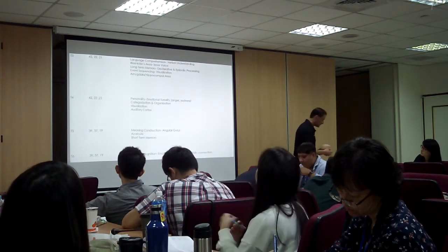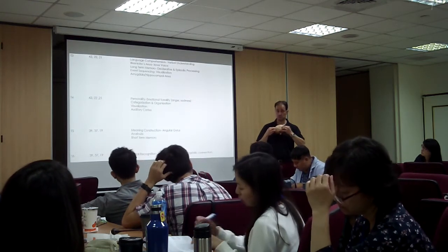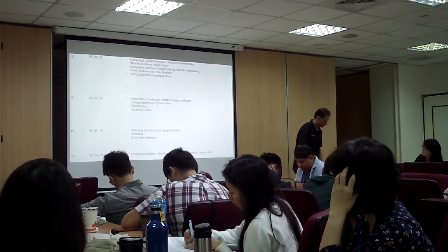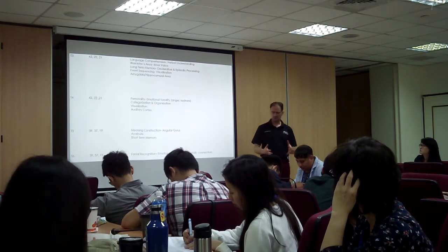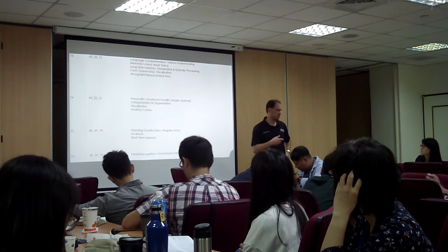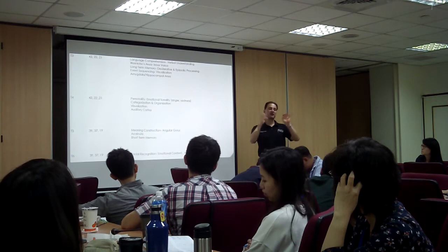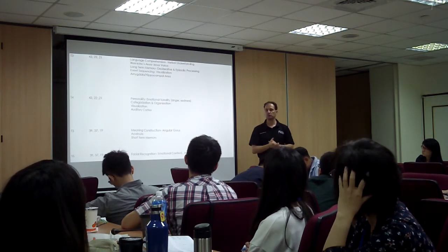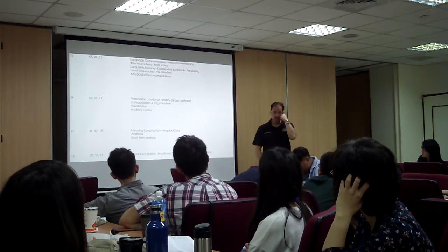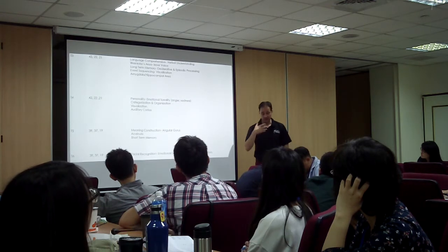And again, T5 and T6 is good for emotional and behavioral regulation too. I had a police captain who came to my office. A very rigid guy, because that's normally how they train them to be. He had some trauma history, he'd been in some shootouts and been shot at. The map clearly showed T5 to T6. For the first session we did a video game, and his sister called me saying he didn't want to go back because he thought he was doing children's play and he's mature. I said, fine, we'll change the training.